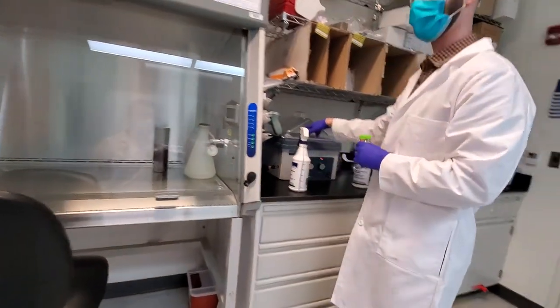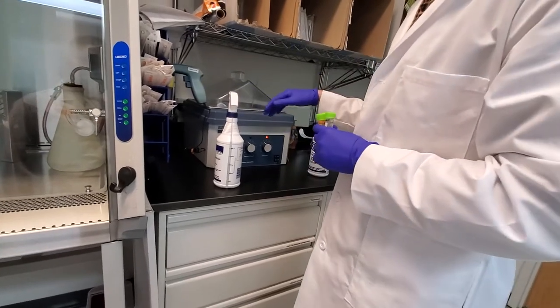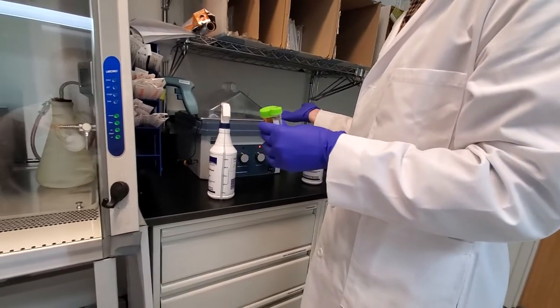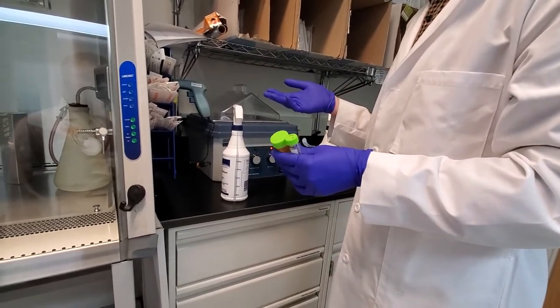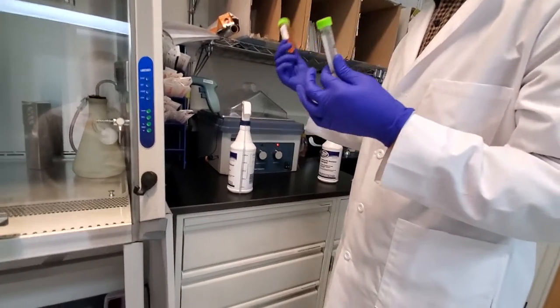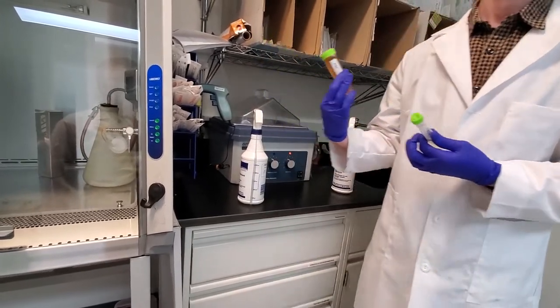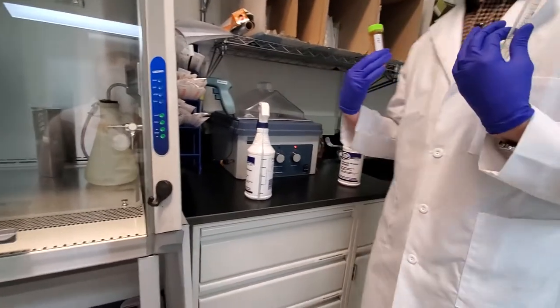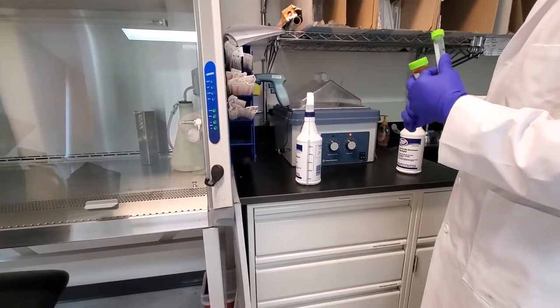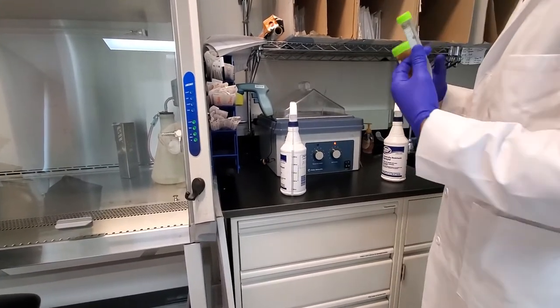I just took a head start and warmed up the media, and then we'll aliquot it out once I add the components. We store the media in the 4C to help preserve it, especially the antibiotic, antimycotic, and the FBS and some of the other components as well. But you don't want to add cold media to the cells, right? It's going to shock them. So warm it up in the bead bath or the bead warmer for a minimum of 10 minutes; you can do it for longer.